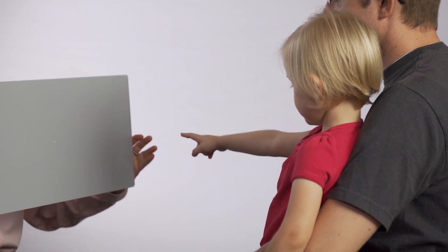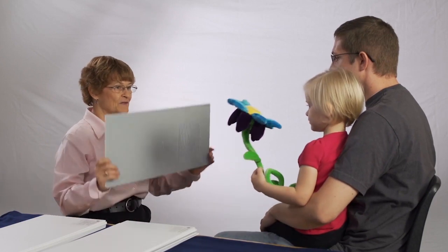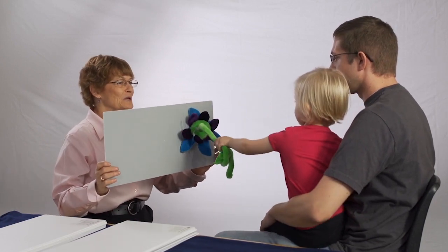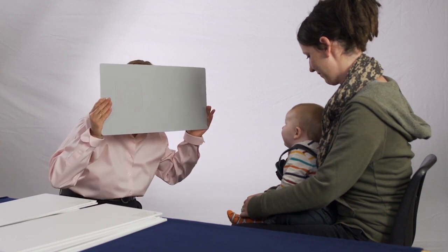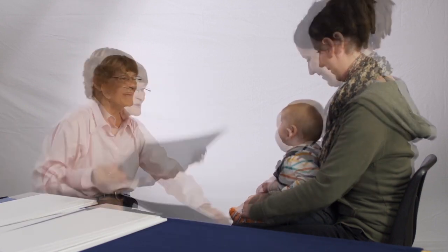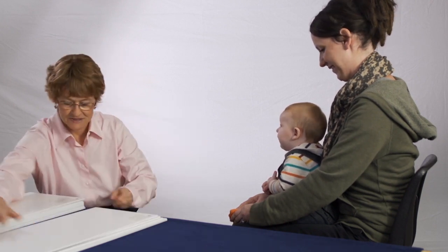During testing, patients may wish to touch the grating or may inadvertently touch it when trying to point to the grating. This should be avoided by giving the child a soft toy to hold and point toward the grating. To keep the patient's attention, the examiner can interact with and reinforce the patient for finding the grating location. Presenting a grating that has been seen previously by the patient can reestablish interest in the testing and also reassure the examiner that the infant is still attending to the gratings.